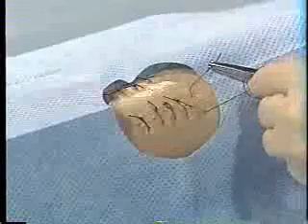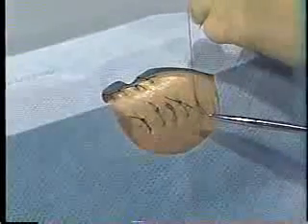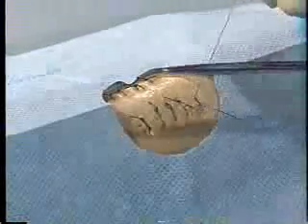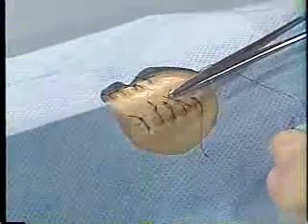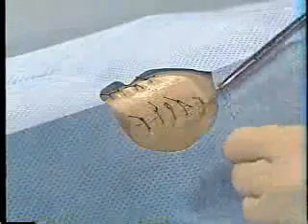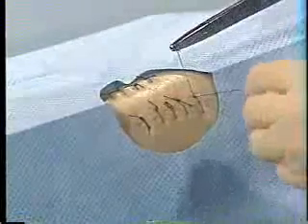Take the short end of the suture with the needle holder and pull it to the other side, watching the throw go down flat. Once again, you have a V with a long end and a short end. Again, insert the instrument in the V. For the remaining throws, wrap the long end once toward the short end, take the short end and pull it to the other side, watching the knot go down square.